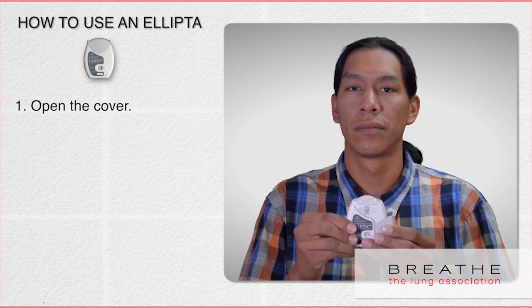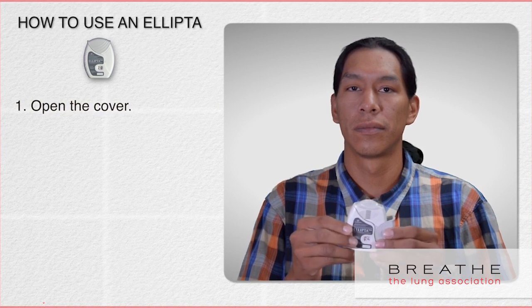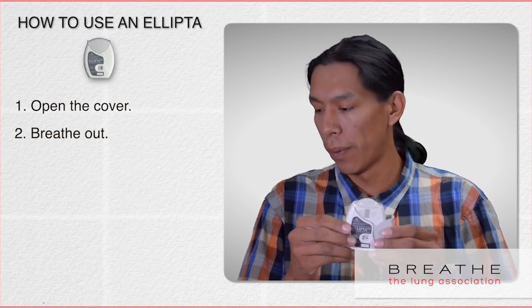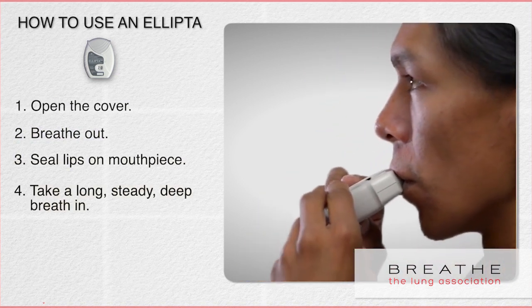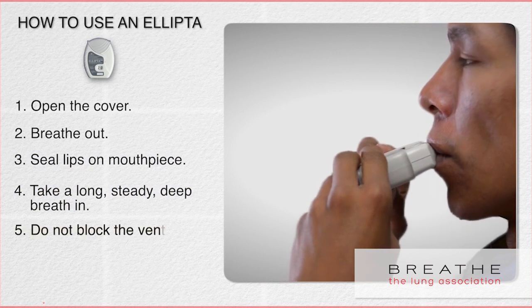Slide open the cover — you should hear a click. Breathe out fully away from the mouthpiece. Seal your lips around the mouthpiece and take in a long, steady, deep breath, ensuring you do not block the vent with your fingers.